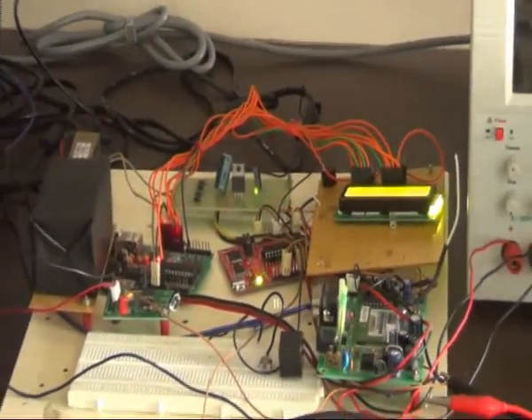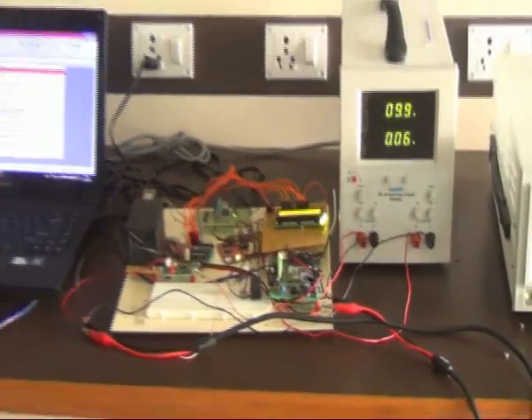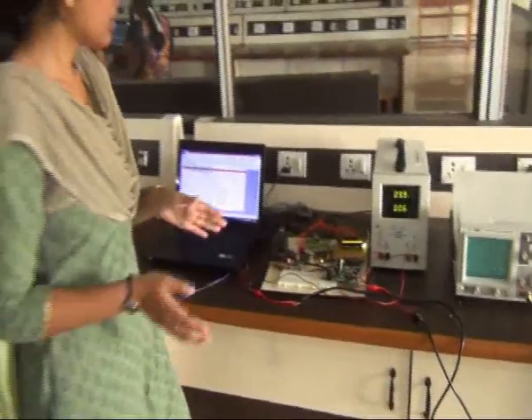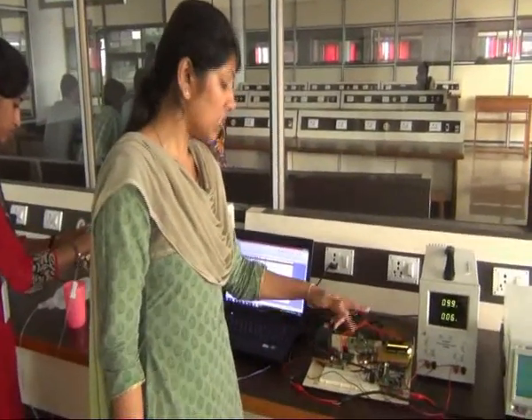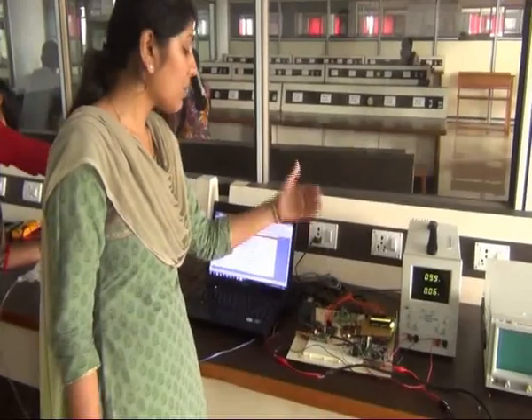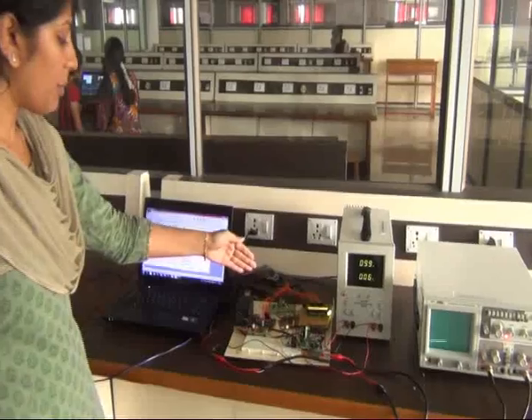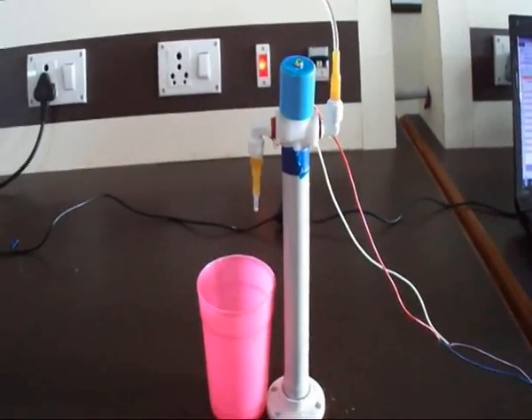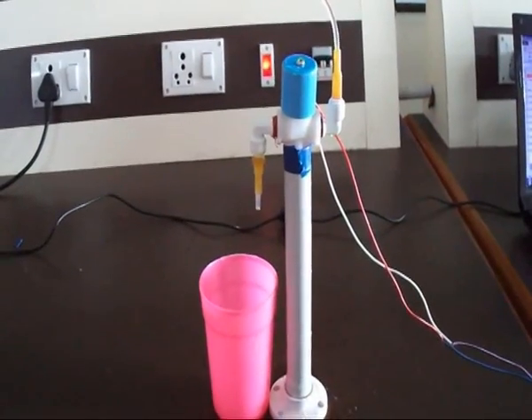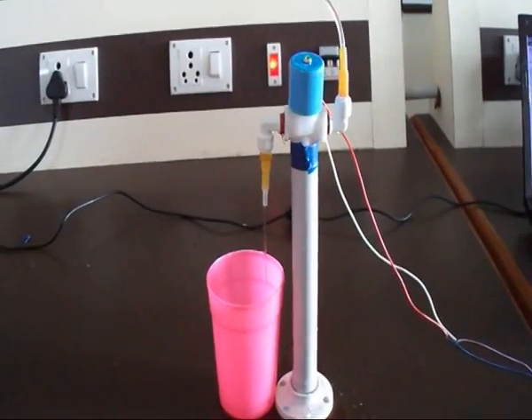The control unit passes this signal to the GSM, and the GSM communicates this signal to the doctor. The doctor, after checking all the patient's body conditions, suggests the anesthesia injection level, which is given back to the control unit through the GSM system. The control unit, after executing it, gives this command to the flow controller, where this flow controller controls the anesthesia injection in the system. For our demonstration purpose, we have constructed this as a 1 second on and 10 seconds off system.